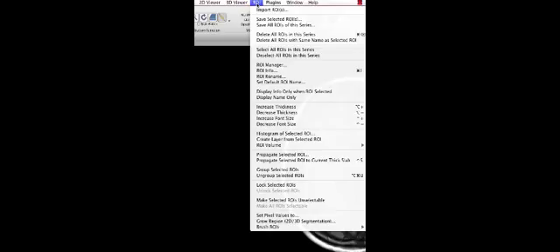In the next step we have to name all the ROIs, that's region of interest, that we created. I think that was for using just one name. So for that you click on ROI and then you go to ROI rename and then this dialog box comes up. Here if you click on all ROIs in this series and then say lesion, you can probably not quite clearly see it, then just click OK.